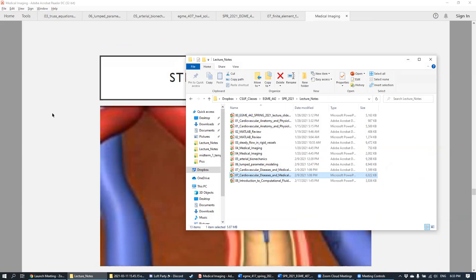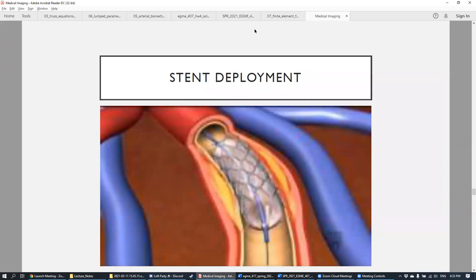Let's see. I think I also saw a catheter with the drill and capture mechanism to remove the blockage. Yeah, catheters, we're not going to talk about catheters all that much, but there's a lot of things you can do on a catheter. So we talked about measuring pressure with it, we talked about deploying stents, but because the catheter is such a convenient device, because it's in the middle of the blood vessel, there's a lot of research out there to say, what other things can we put at the end of the catheter that would be useful for either research or for treating patients. I haven't heard about that one, but that makes a lot of sense that they would have something like that where they can drill into a plaque and then remove some of the blockage from there too. So that's actually pretty clever.